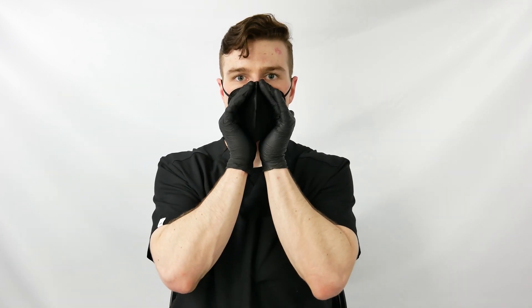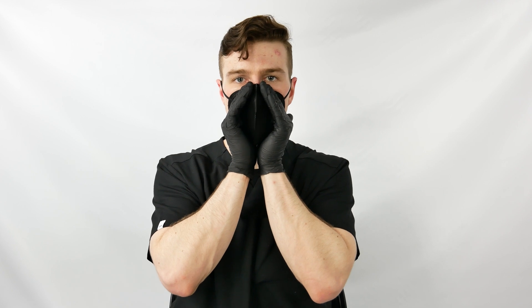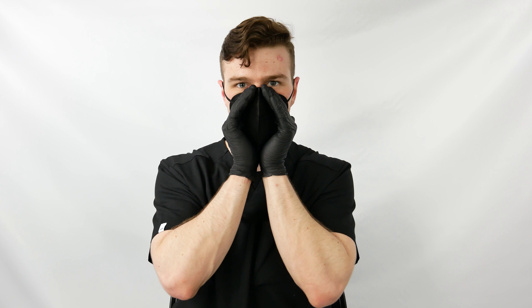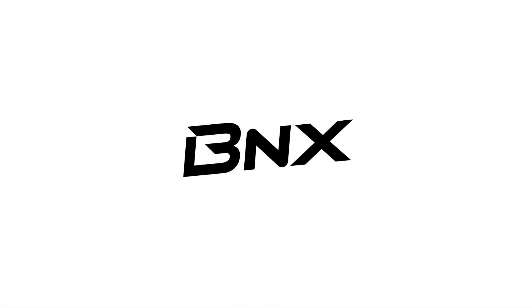Then perform the seal test again. Ensure there is no leakage around the edge of your mask. And that's all there is to it!